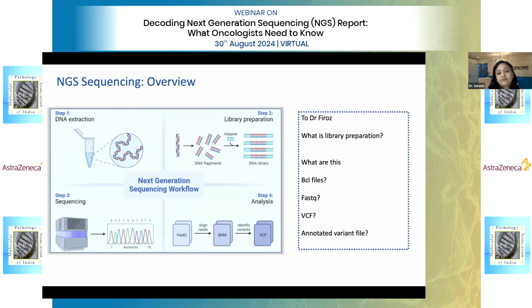Can it happen that we can make a guideline so that anybody who issues a lab writes over there and then sees the thing, because it will save time? Definitely, it will save time if that's done. But as a CAP accredited NGS lab, it is like a first QC step that has to be done, because if tumor cellularity will not be there, there is a chance that the NGS report can be false negative.